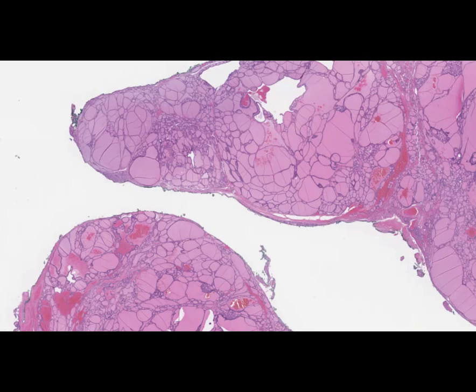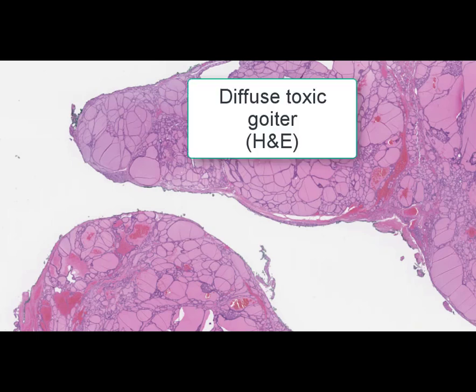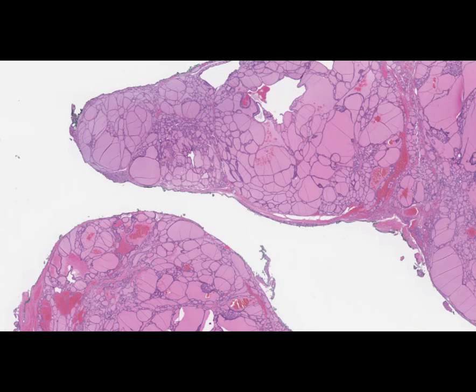On this slide we can see a thyroid gland, stained by hematoxylin and eosin. The name of this slide is diffuse toxic goiter. By definition, goiter is an enlargement of the thyroid gland. It can be diffuse or nodular, and it can be accompanied by increased or decreased functionality of the thyroid gland.